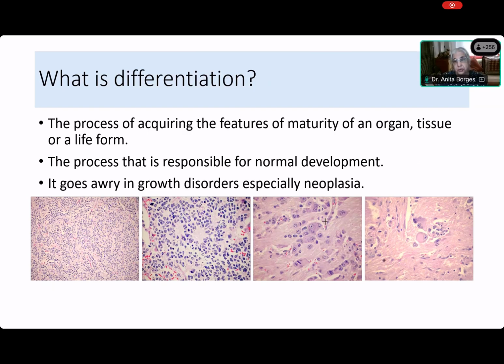You've seen a ganglioneuroblastoma. So at least here, I'm giving you all the hints. So here is differentiation that is being seen. You don't see all stages in all neuroblastomas. Sometimes you won't be seeing an undifferentiated neuroblastoma. The most common neuroblastoma that you see is the second picture, which is the rosetted neuroblastoma. And you see ganglioneuroblastoma and you see ganglioneuromas. And here is a neuroblastoma that has this fibrillary matrix, and it's not a matrix, it's actually the cell processes. And you see the neuroblasts are differentiating and ultimately will become ganglion cells. So this is a matter of putting all these pictures together and trying to make some kind of sense out of what is being seen.